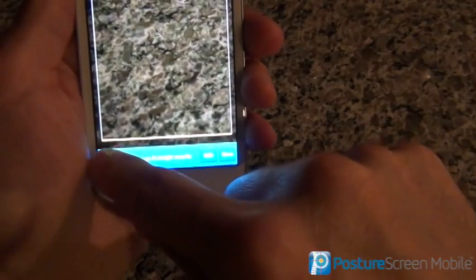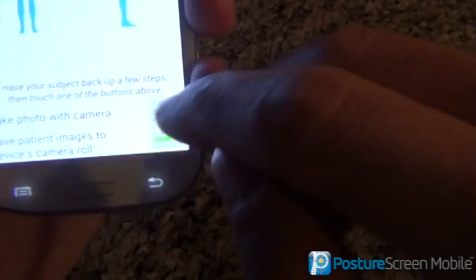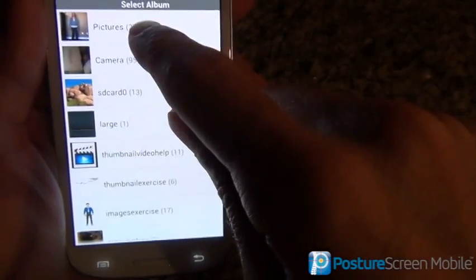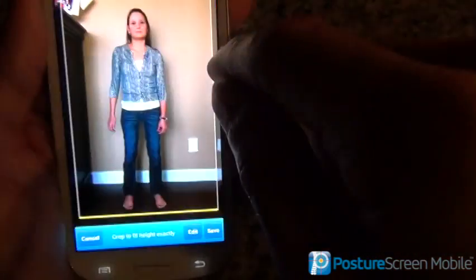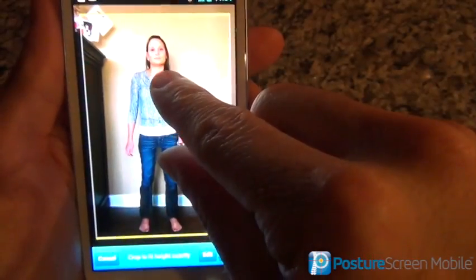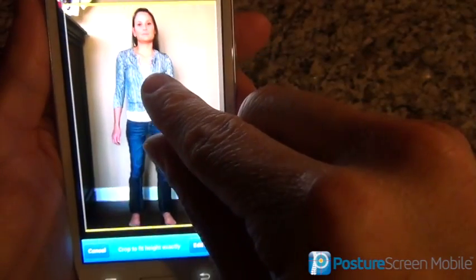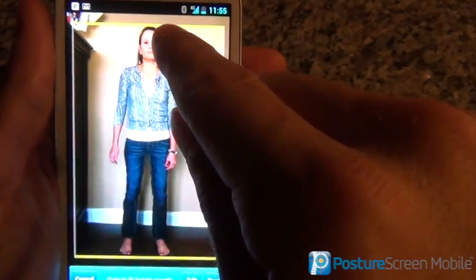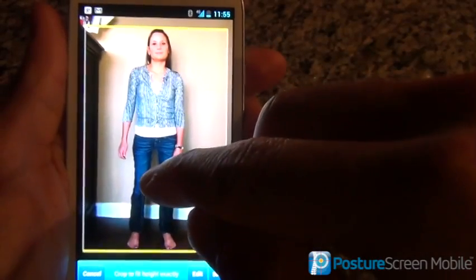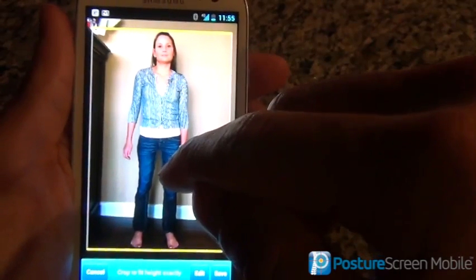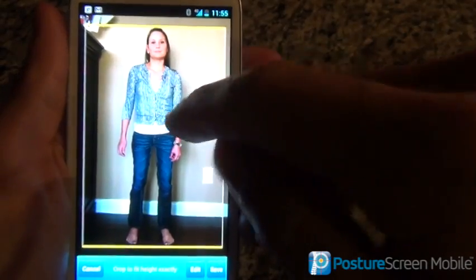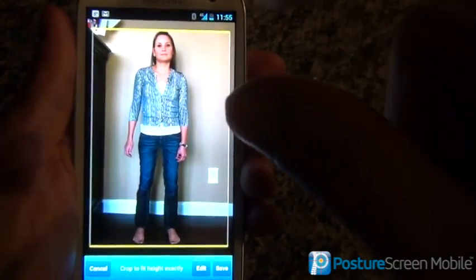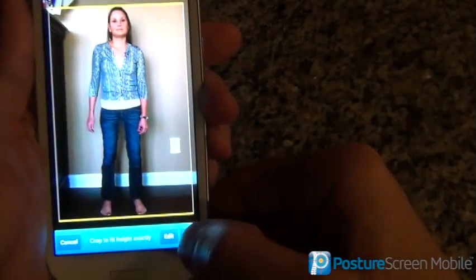I'm not going to save this one — I'm going to show you the alternate method. We're going to turn off the camera and browse to the images. I have two images here: a front view and a side view. I'll import that. You can see I already had a photo taken — I'm going to zoom and pan. Notice the most important part for calibration: the top of her head is at the yellow line and the bottom of the feet at the yellow line. This is crucial if you want the millimeters or inches displacement to be accurate. We need an accurate height on her. If you mess this up, you will have readings that are not as accurate for the millimeter translational distances. Let's go ahead and hit save.